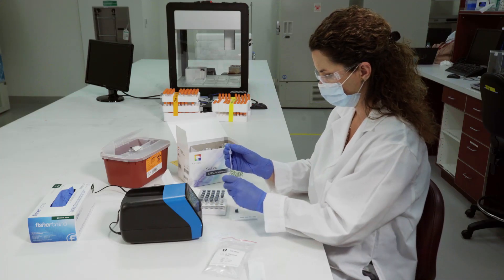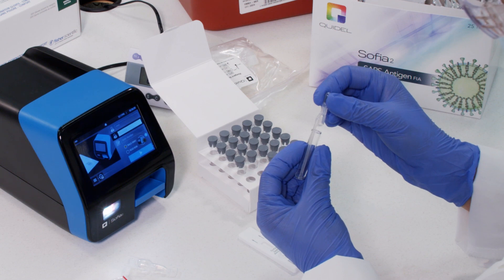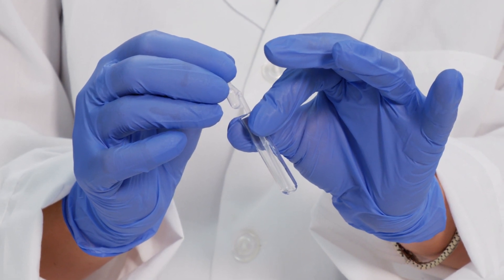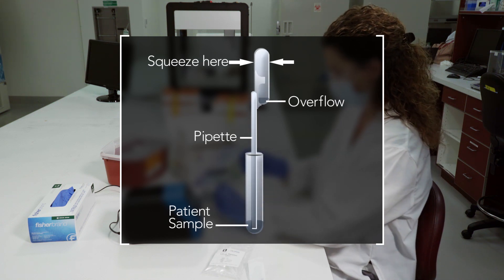Firmly squeeze the top bulb of the clear fixed volume pipette, then place the pipette tip into the sample. With the pipette tip still in the sample, release pressure on the bulb to fill the pipette. Ensure there are no bubbles in the pipetted sample. Users must ensure the pipette tube is filled to an adequate volume. Extra liquid in the overflow bulb is okay.